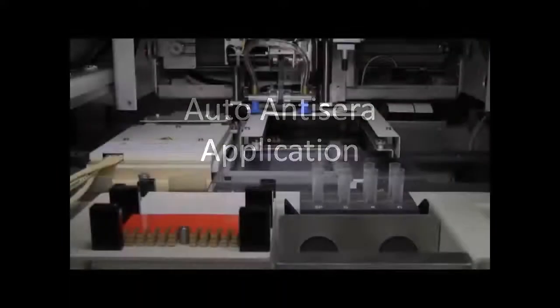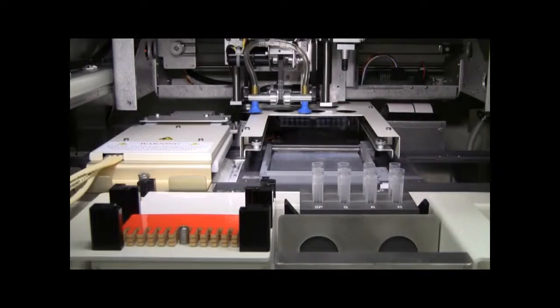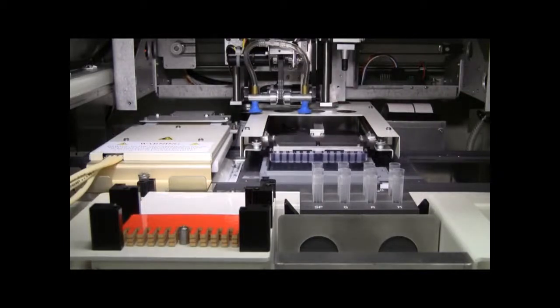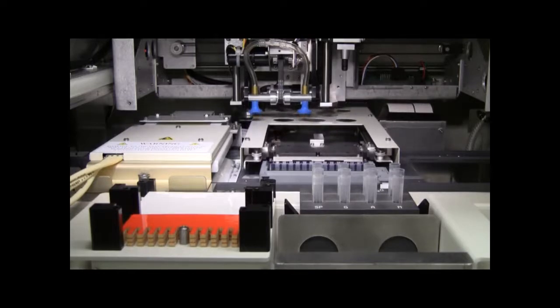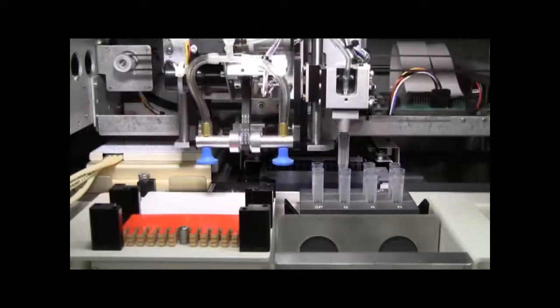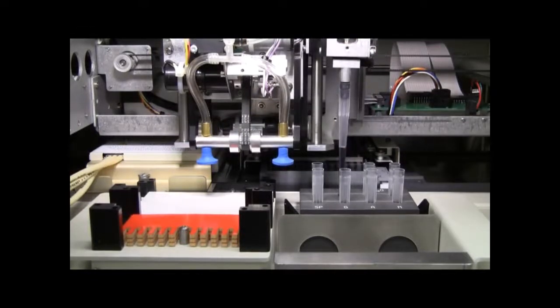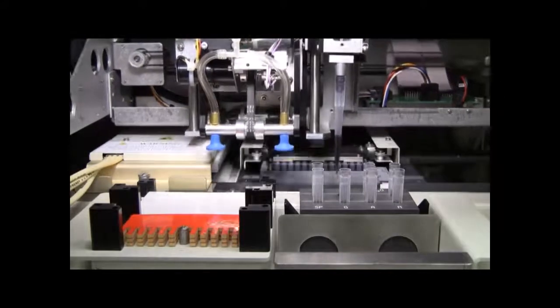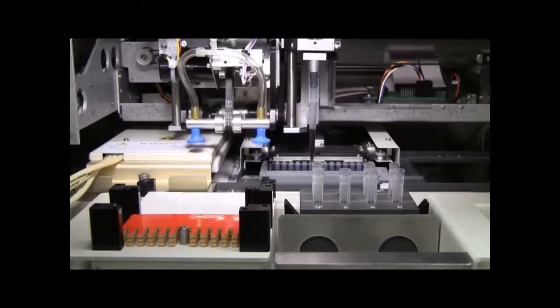After electrophoresis, the agarose gel is moved into the anti-sera application station. Once it's in the station, an anti-sera template is moved over the agarose gel and lowered onto the gel. Afterwards, a pipetter automatically picks up the correct anti-sera and loads it onto the anti-sera template for anti-sera application onto the agarose gel.